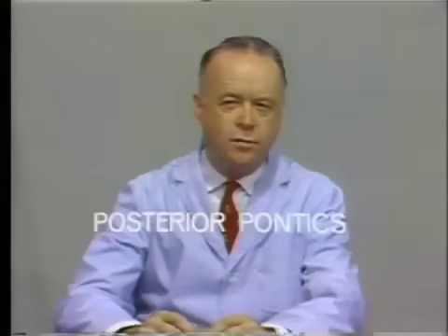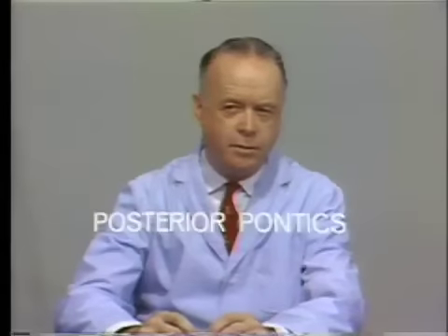Let's take a look, first of all, at the situation of posterior Pontics. You might think it would be a very easy thing to replace a missing tooth by just having an artificial one which is essentially the same shape and design, and just substitute this in the position in the mouth. The orange tooth in this diagram represents a mandibular first molar with the surrounding alveolar tissue. When this tooth is extracted, changes take place in the relationship of the alveolus there, as you know, and the alveolus recedes away.